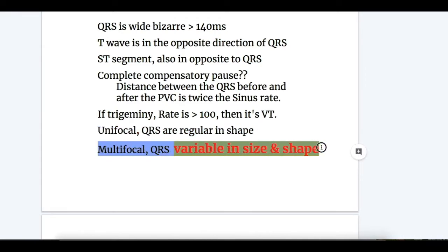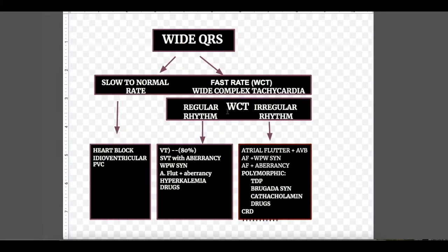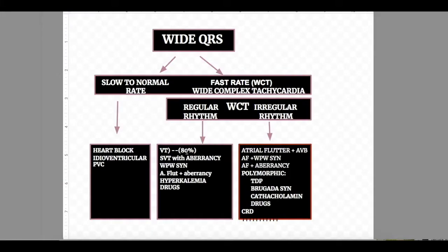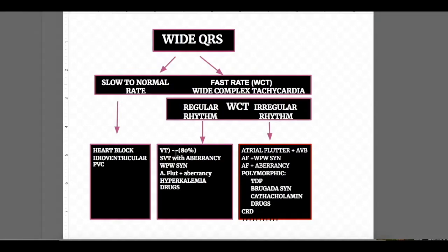Now, wide complex tachycardia with regular rhythm: the most common cause — 80% of cases — is ventricular tachycardia. Supraventricular tachycardia with aberrancy accounts for 15 to 20% of cases. Other causes include atrial flutter with aberrancy, which causes regular rhythm wide complex tachycardia.